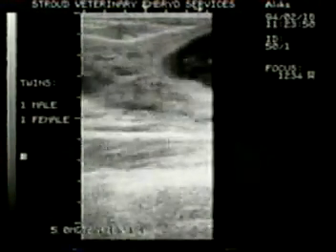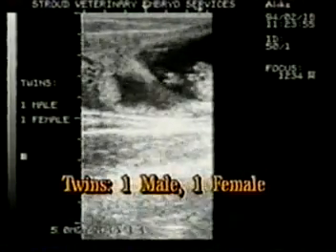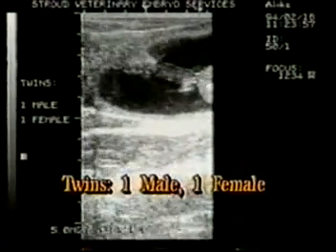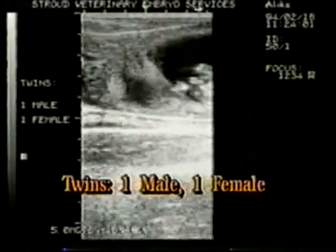In the case of free-martin twins, it may be desirable to eliminate them. In any case, it is important to know that a cow will have twins, so that appropriate management efforts can be in place at or near calving.